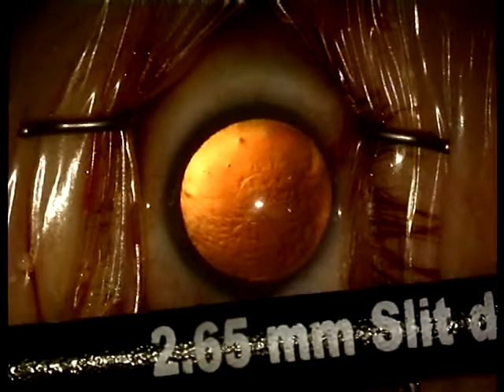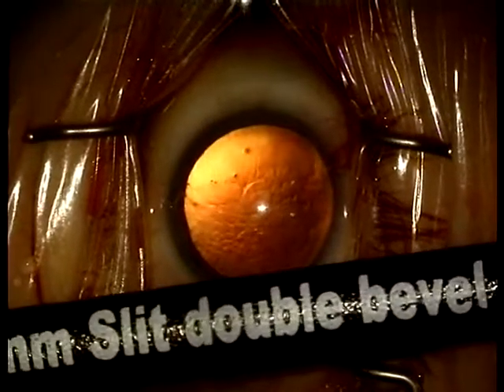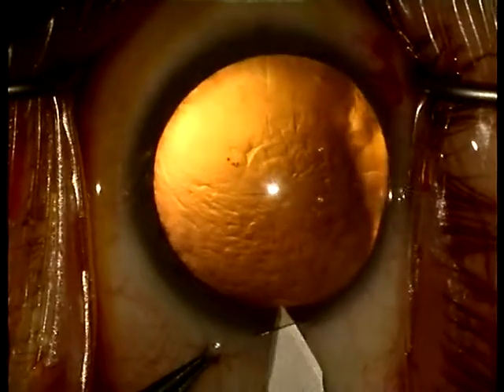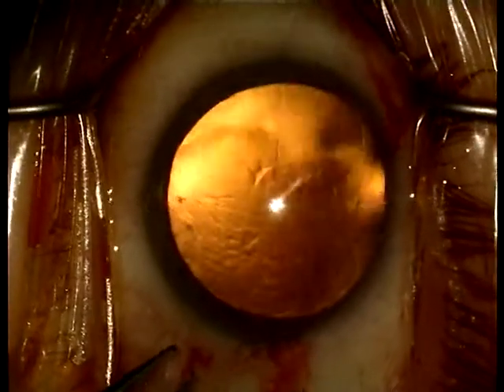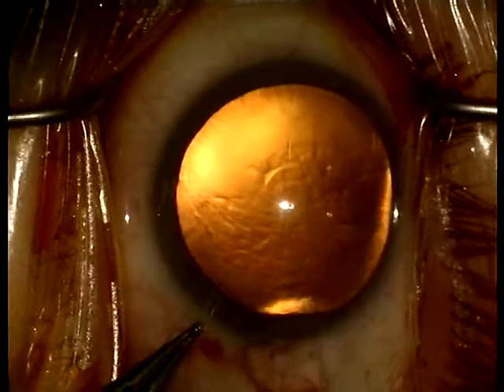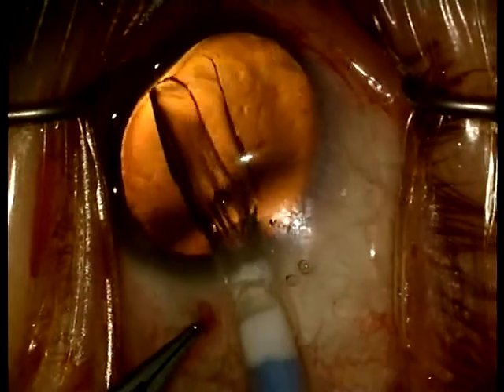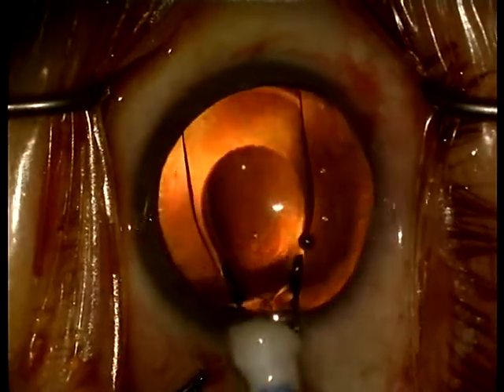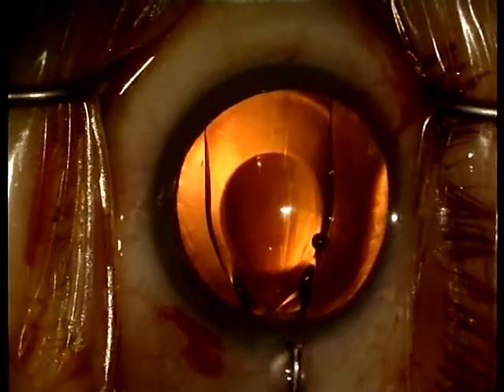The main incision is performed with a 2.65 mm double bevel knife. The cartridge is then placed firmly against the incision and the ICL is injected. Wait to remove the cartridge until the distal part of the ICL is unfolded.